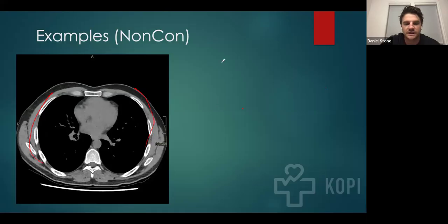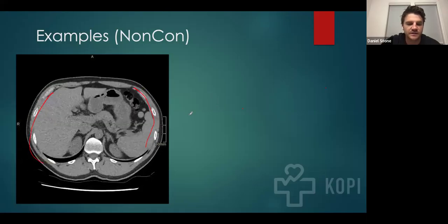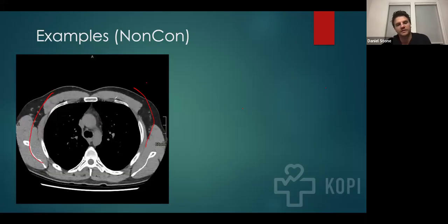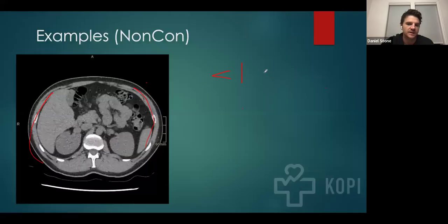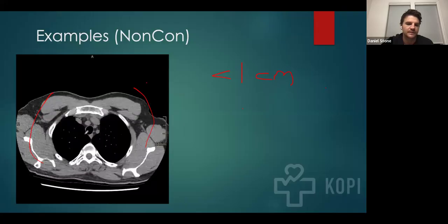What I will say though is that there's an increasing frequency of incidental findings, specifically in CTs of the chest, where you see lung nodules. We can talk a little bit more about what a concerning lung nodule is, but just know that something less than 1 centimeter is usually benign. Doesn't necessarily mean that it needs follow-up.